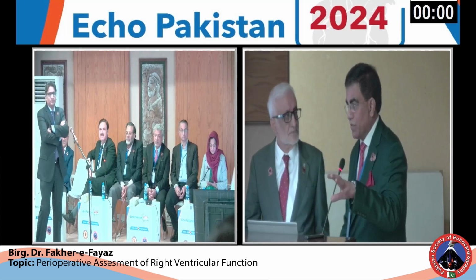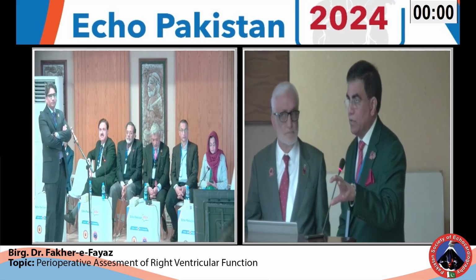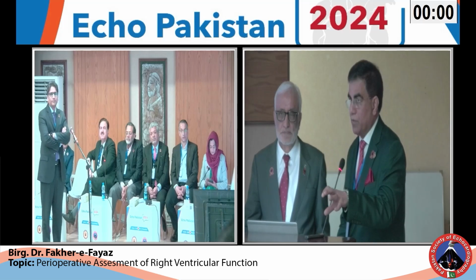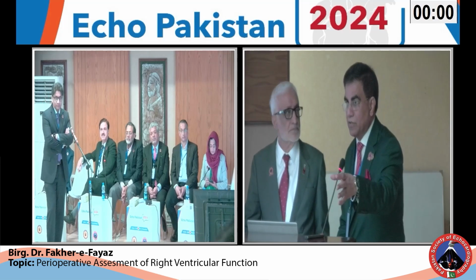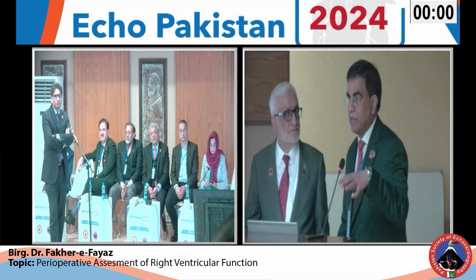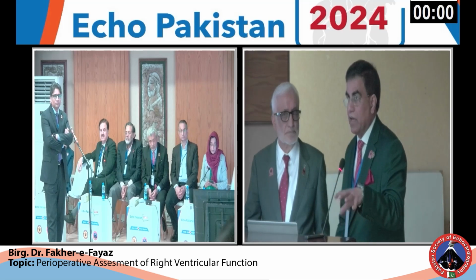It's a very good question. Definitely, Echo is going to help you, because that's the only tool which you can use in the perioperative period when the chest is open. Yesterday or the day before yesterday, someone was asking why did you not do the chest auscultation. So I said, you cannot do it, the chest is open. But you can do transesophageal echo, okay.